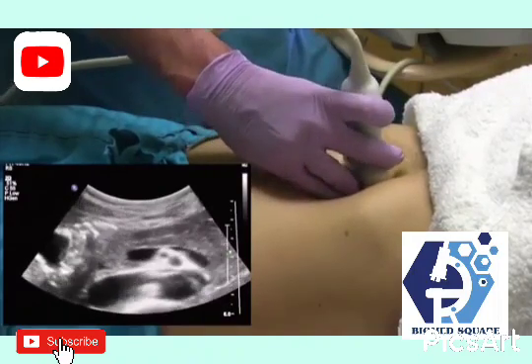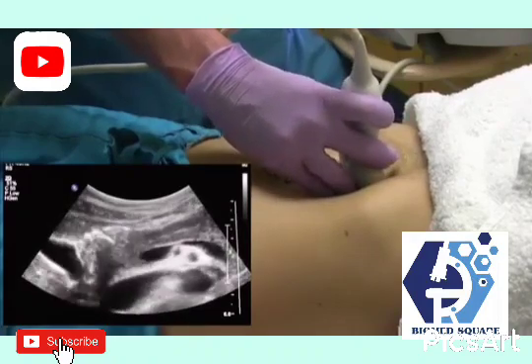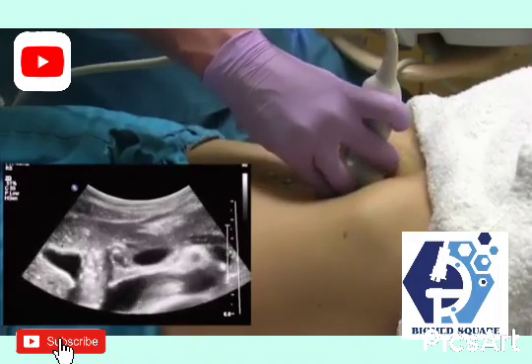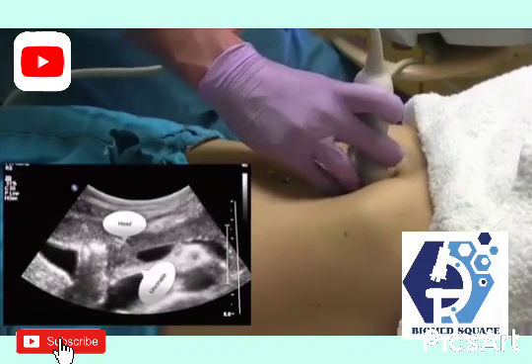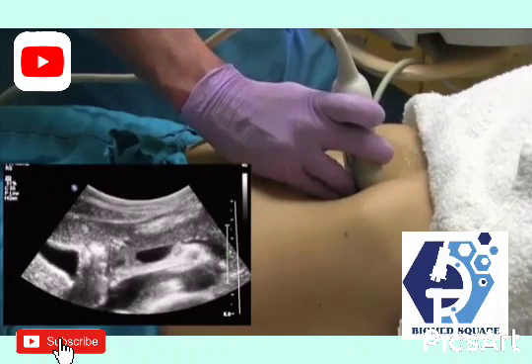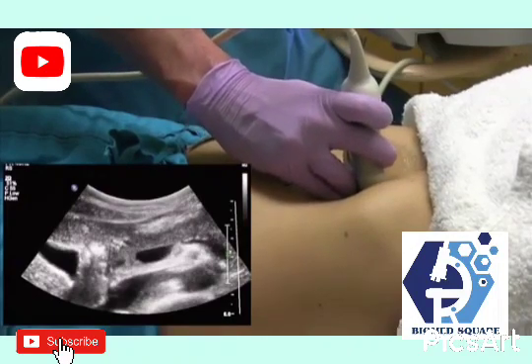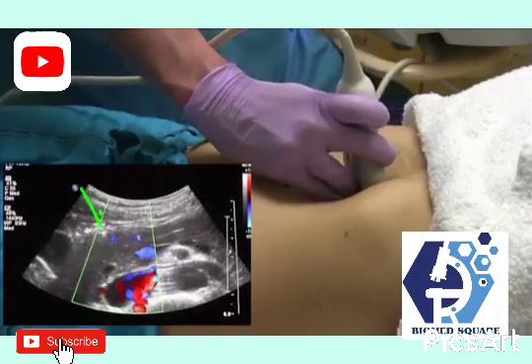If you angle towards the patient's right side here, you'll be able to see the head and uncinate process of the pancreas. If the patient has a good scan, you may be able to see the gastroduodenal artery, or GDA, in the anterior head of the pancreas.